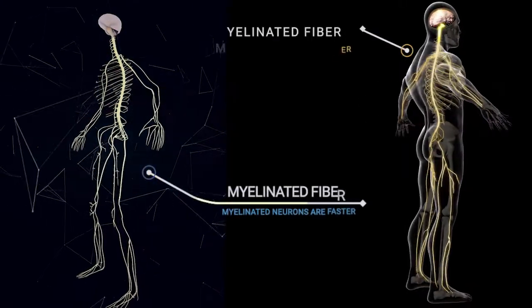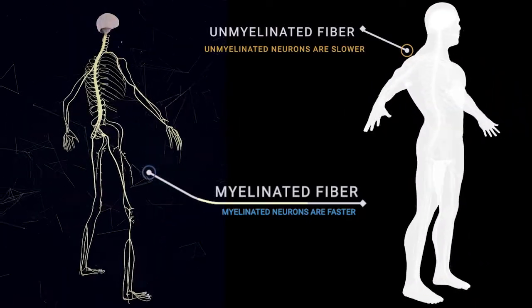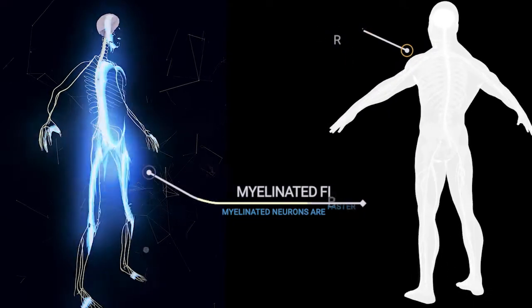Now, think of your nerves. For the most part, you have two types of nerves: a large myelinated fiber and a small unmyelinated fiber. Myelination means it has a covering over it, which makes it go faster. It's typically the sharp, shooting type pains. The unmyelinated fiber deals with dull, achy pain. I'm gonna keep it simple. When you have an injury, the large myelinated fibers, when they're working right, inhibit the small unmyelinated fibers. If you get injured, you mess up the muscle spindles and the tissue nerves. These aren't working right, so they're no longer able to stop the unmyelinated fibers, and that's where the dull, achy pain comes into effect.